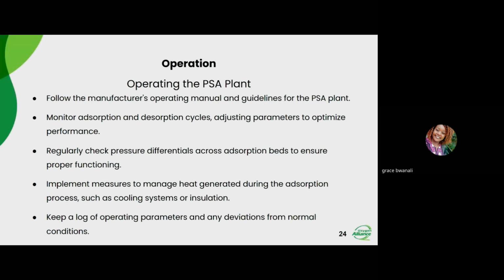Yeah, so cylinders, there are some important measures that you have to check. Normally, when you're working with cylinders, you have to make sure that these cylinders that you're using are good cylinders. They don't have any cracks. We should also make sure that the cylinders have the valves in place and they are well fitted, and also they have the valve guards. This prevents them from being destroyed in any cases, for example if they fall down.